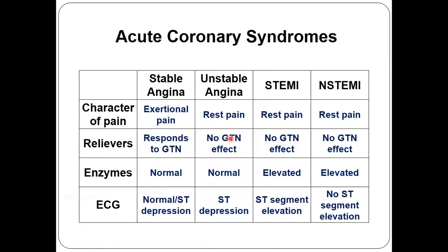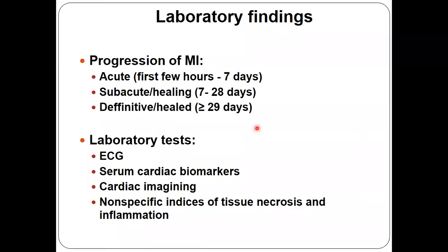Now, the time and duration of MI and the different phases. At first glance, when we have a transmural lesion, that's manifested as an ST elevation. That's the hyperacute stage, which starts immediately and lasts for hours, because if you're not doing anything, necrosis develops. They used to diagnose acute when we have a sign of necrosis. Today, if somebody has the clinical sign of MI, the patient is taken to the cath lab and they implant a catheter, and of course they put in a stent, and the ST elevation disappears and the patient never had MI. Now that's the hyperacute stage.